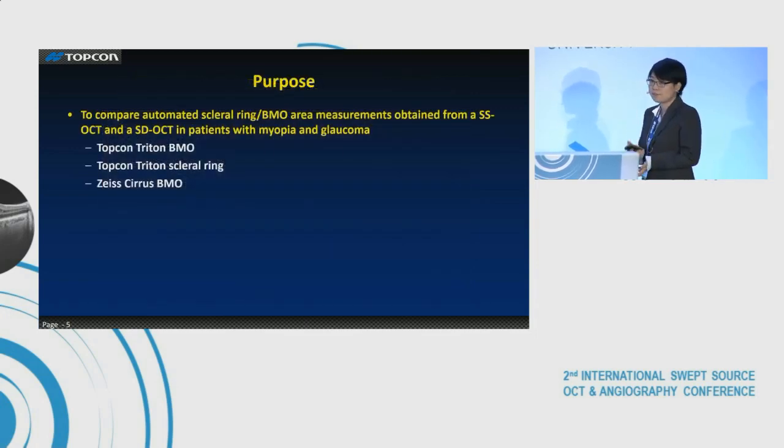To compare the different disc detection methods in swept-source OCT and spectral-domain OCT, we conducted a study in patients with myopia and glaucoma. And the three methods we're going to compare are the Topcon Triton BMO, Topcon Triton Scleral, and Zeiss Cirrus BMO-based disc detections.